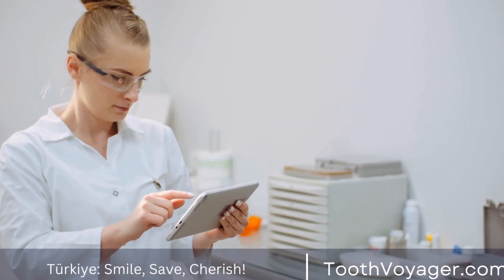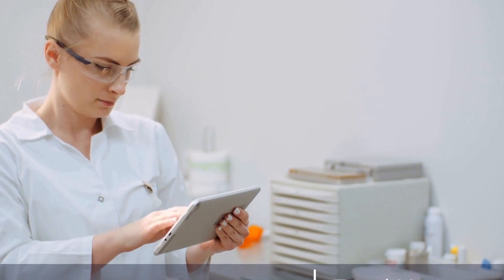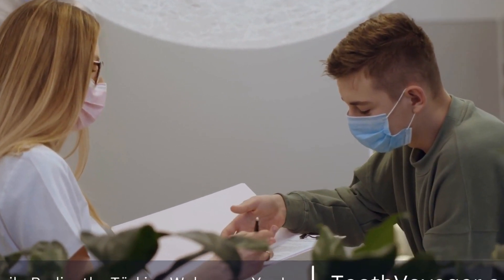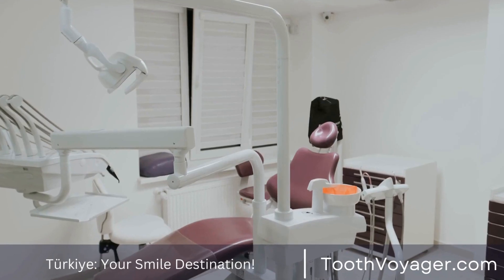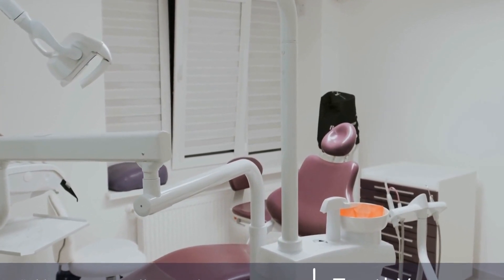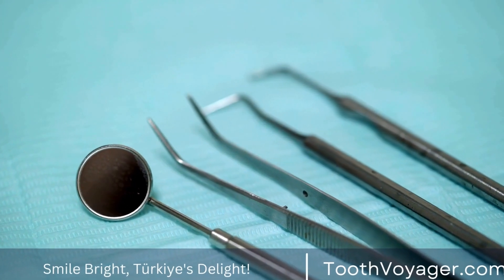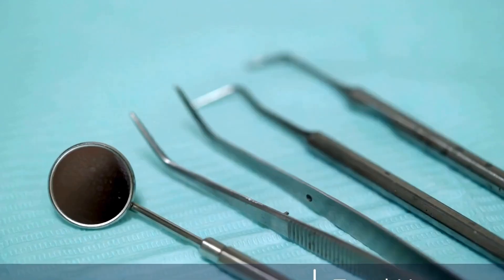The Role of Technology. Advances in technology have revolutionized the field of dentistry, making the process of crafting custom dental crowns more precise and efficient. Computer-aided design and manufacturing (CAD-CAM) technology allows dentists and technicians to design and fabricate crowns with incredible precision. Using a digital scan of the patient's teeth, dentists can create a 3D model of the crown and make adjustments as needed. This eliminates the need for messy impressions and ensures a more accurate fit. The CAD-CAM system then mills the crown out of a solid block of ceramic, eliminating the need for traditional casting techniques.